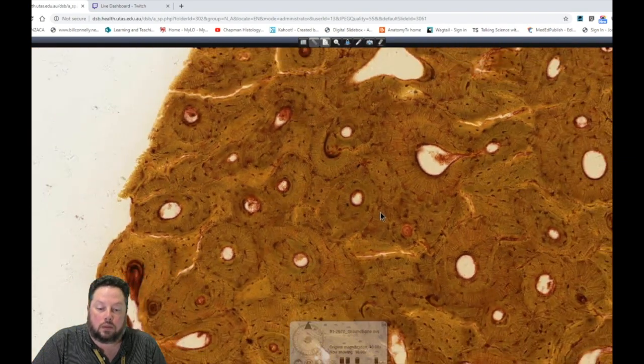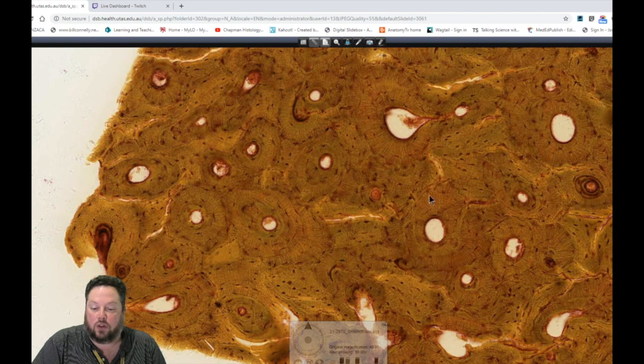So this is what we're seeing. So we're seeing lots of these osteons.